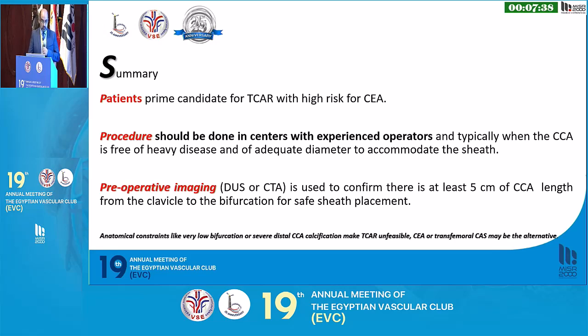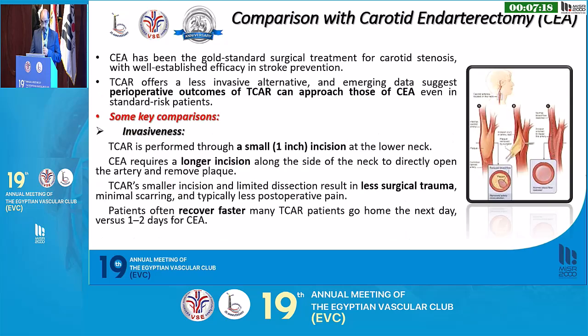As a summary of the indication for the patient: the prime candidate for the TCAR is at high risk for carotid endarterectomy, and the procedure is done in a center with an experienced operator. Preoperative imaging, either by duplex or CTA, should confirm that at least 5 centimeters of common carotid length from the clavicle to the bifurcation is available for safe sheath placement.